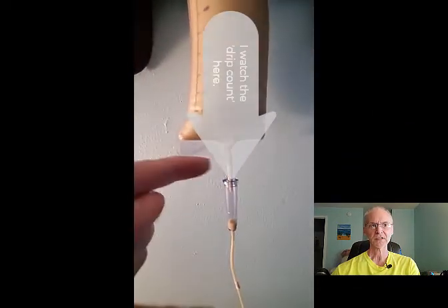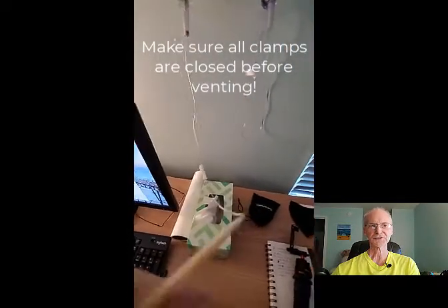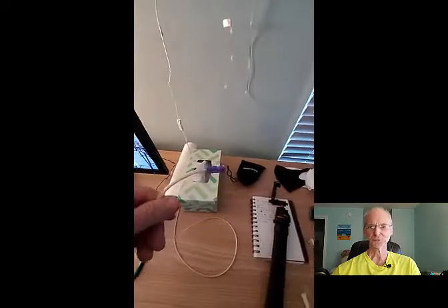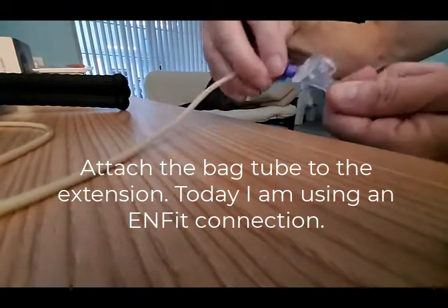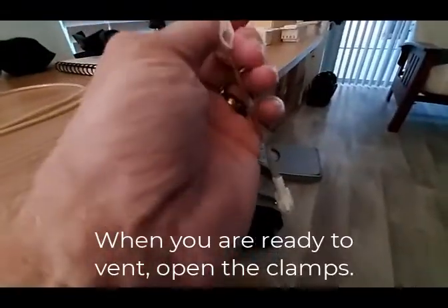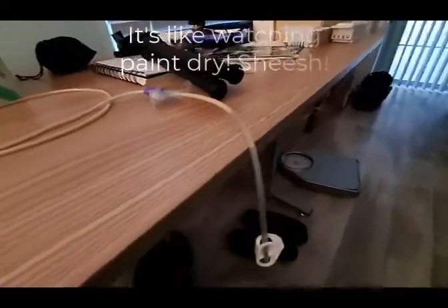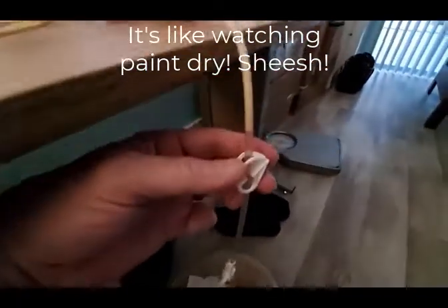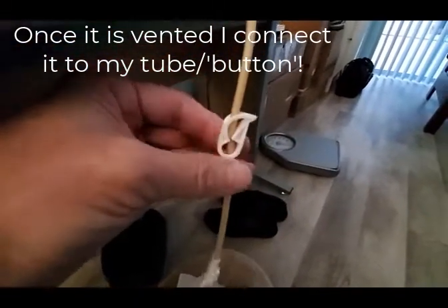And you can see here, I should monitor the drip rate when it's above my eye level. I always make sure the clamps are closed. But one of the main things you have to do is always vent. That means getting rid of all the air in the tube, because for people with different conditions, having air in the tube is a bad thing. For me, it just causes gas in my digestive system. Venting takes a long time, or it feels like a long time. But once it's vented, I'll put it in.